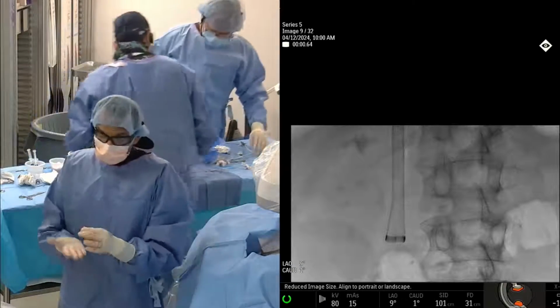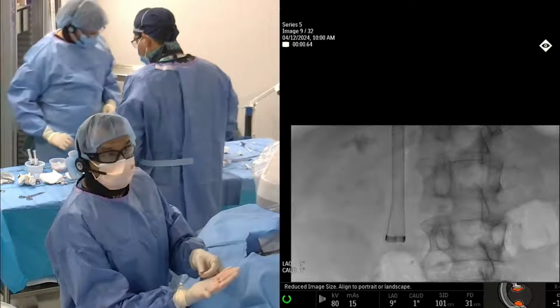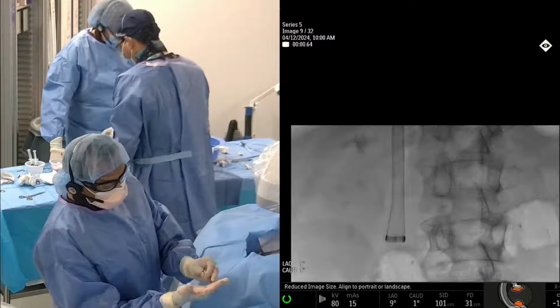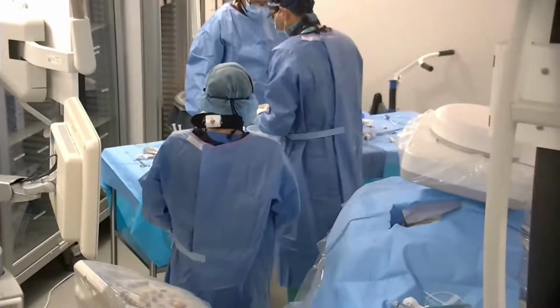So here's the filter just to show that all the legs are here, all 6 legs. I don't know if you can see it from here. I'm not sure if they can zoom in on this, but we'll take a picture and post it later. Yeah, good idea.